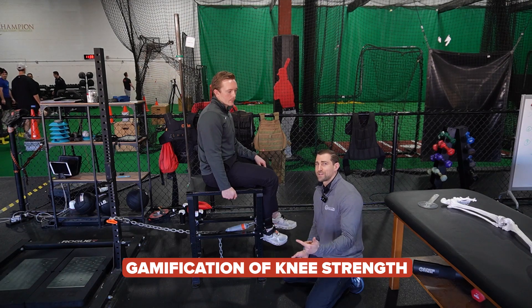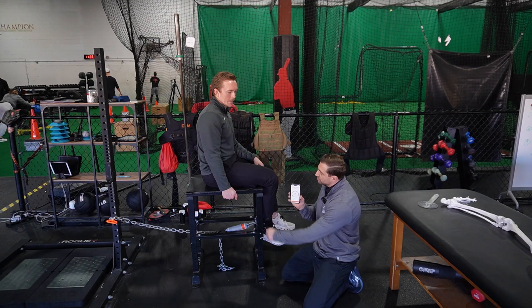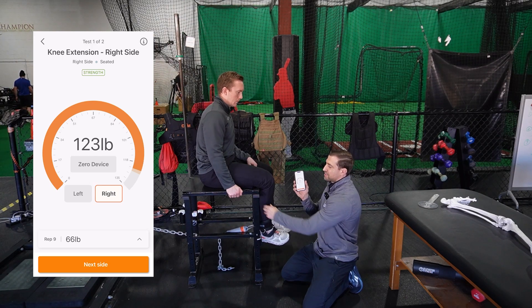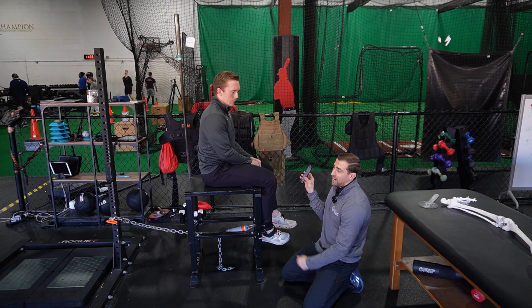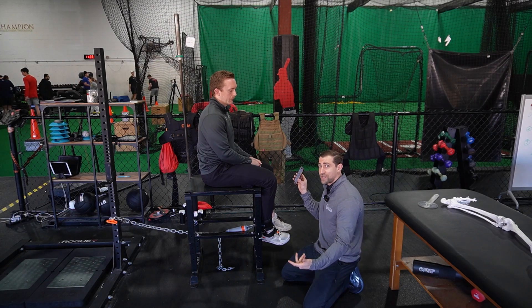What's really nice about the Vald Dynamo is you can gamify knee extension and hamstring curls a little bit. While your athlete is performing their handheld dynamometry, I'll show them the cell phone so they can see the force number go up in real time. The idea is to get as high as you possibly can, which is pretty motivating.